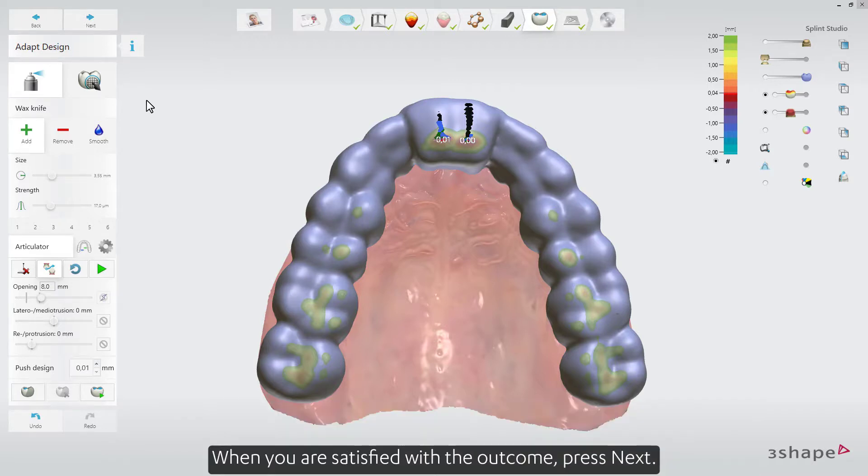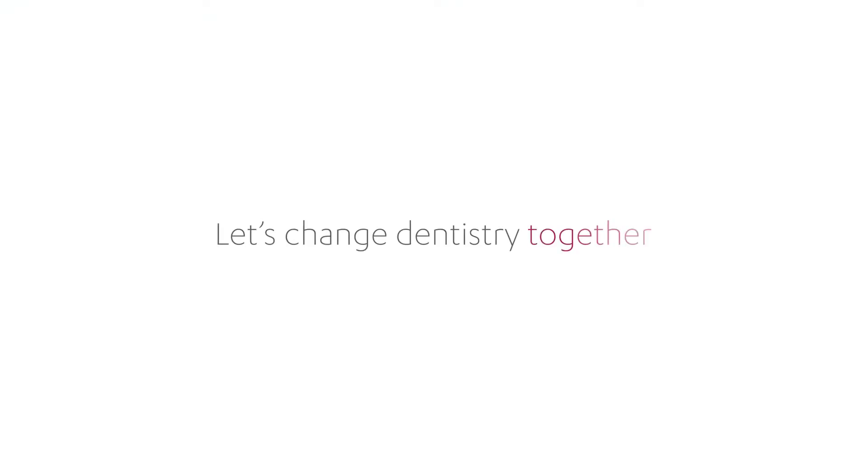When you are satisfied with the outcome, press Next to proceed.